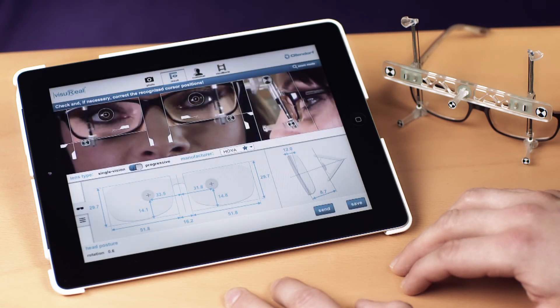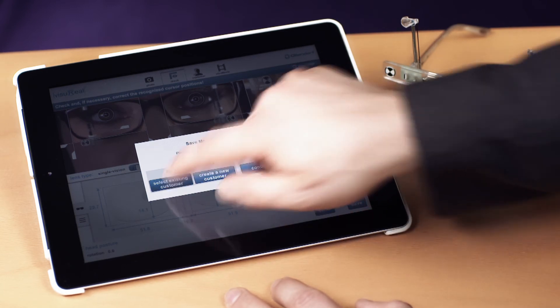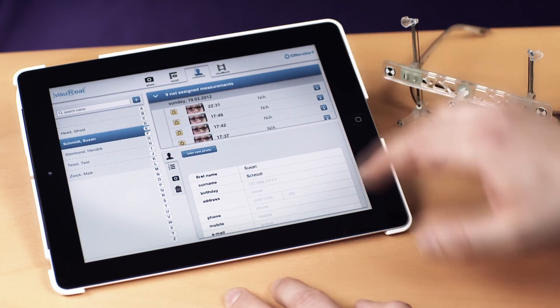There are different ways of saving the results — for example, assigning them to an already existing patient file. Search for the desired patient and assign the results respectively.